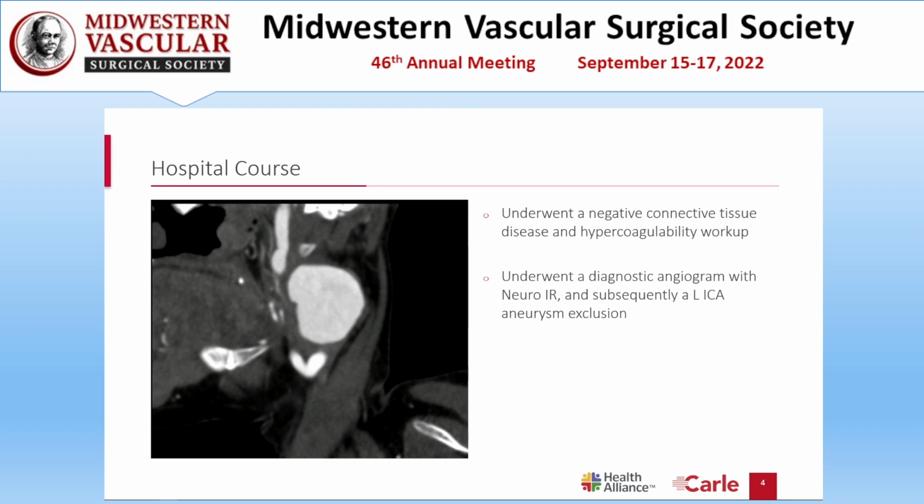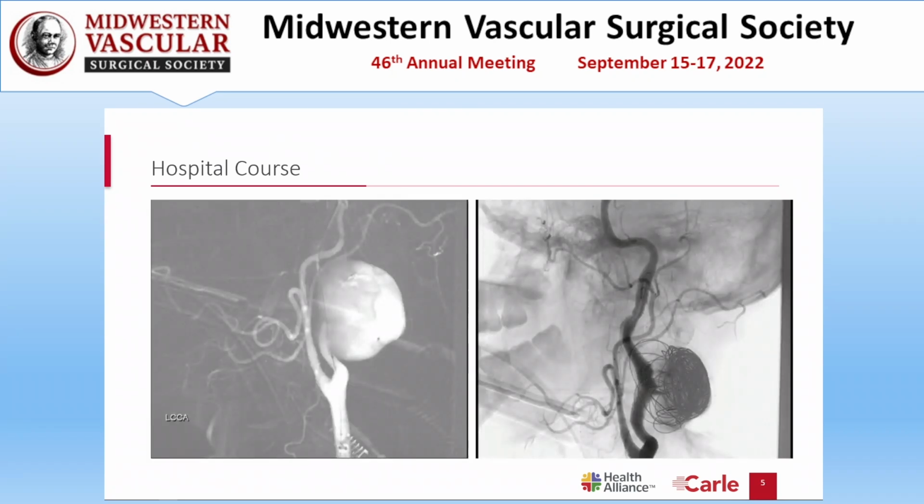She underwent an angiogram and then subsequent exclusion. So, 2 pictures from the procedure. Initially, when we got our carotid angiogram, you could only see a little bit of the flow into the distal ICA due to compression from the pseudoaneurysm.